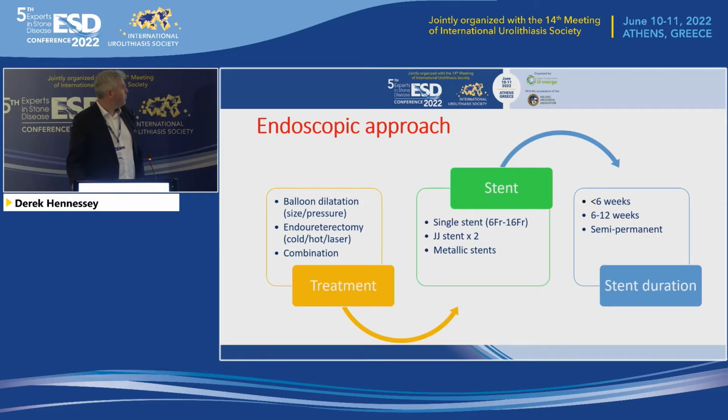So again, when you're faced with a patient, the things you're going to consider is, will I balloon dilate this? What size balloon and what pressure and for how long? Will I cut it? Will I cut it with a cold knife, hot knife, or will I use a laser? Will I do a combination? And there's some decent evidence for these. When it comes to stent size and stent duration, the evidence is not as good, even though there is a randomized controlled trial with regard to that.